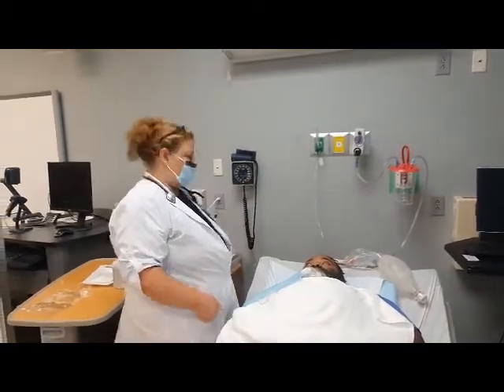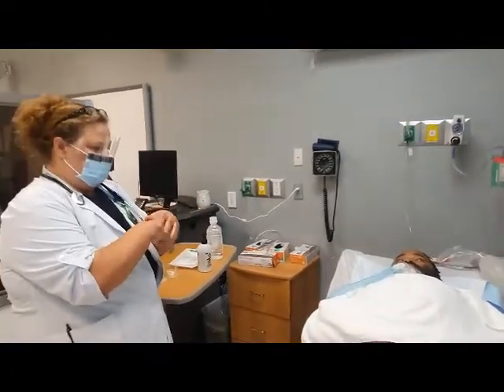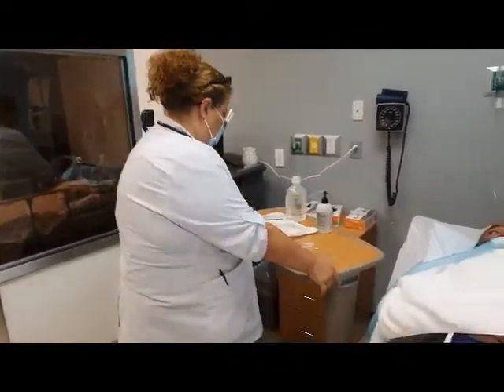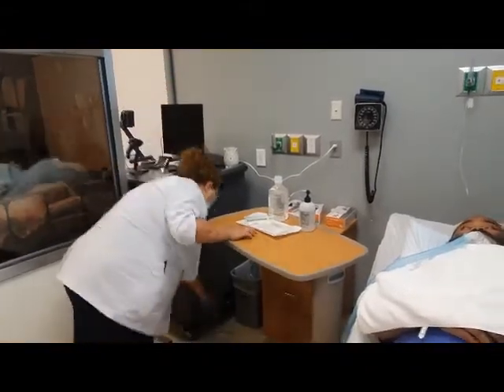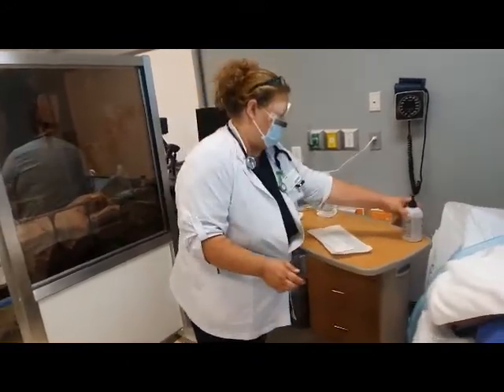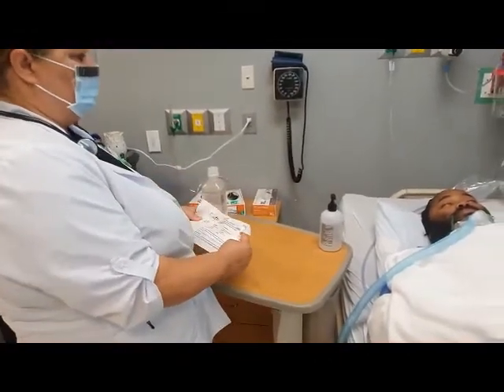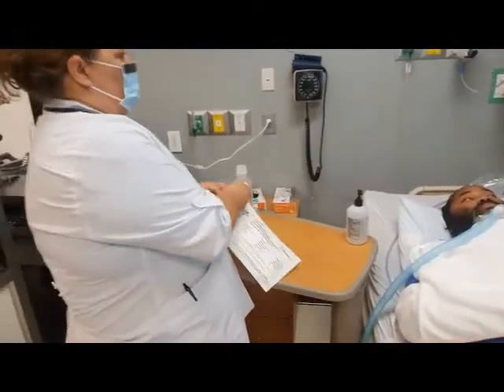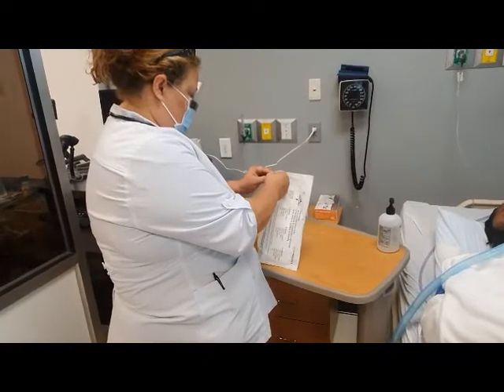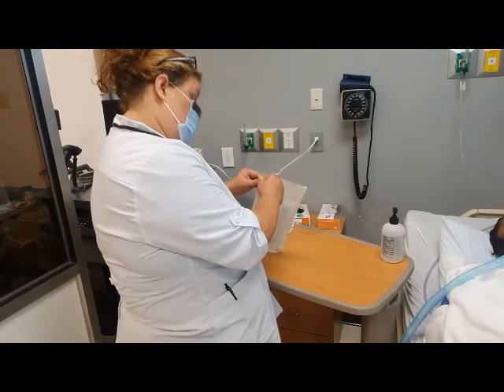Clean your hands. And you'll open your sterile suction kit. Okay. So I've made sure that I had all my supplies in the room and that I've got my suction ready. The patient knows what I'm going to do. And you're thinking right now, okay, do I have everything the way I need it? Then you're going to open up your kit.